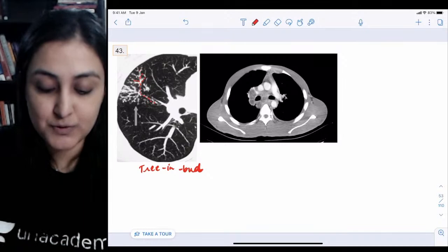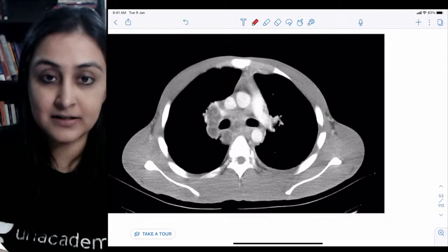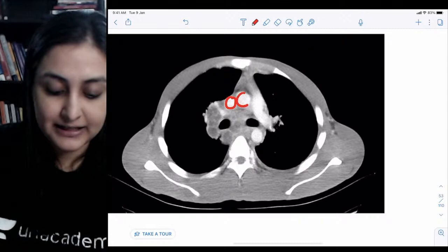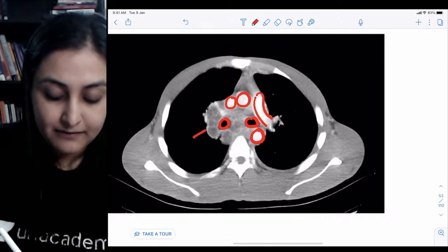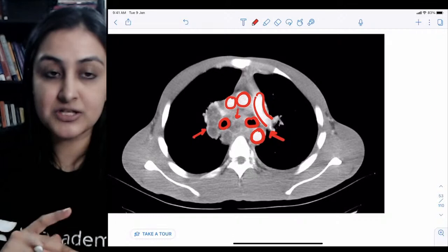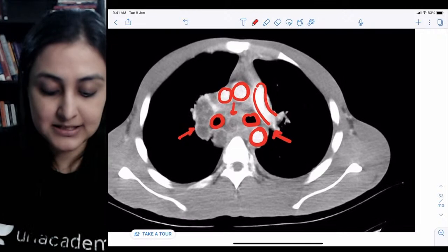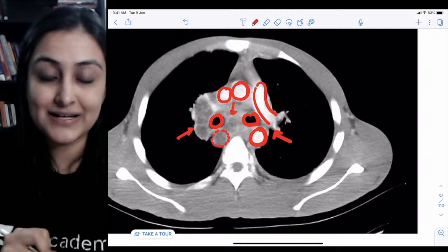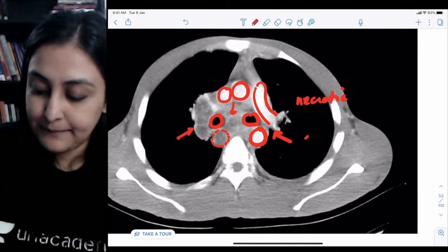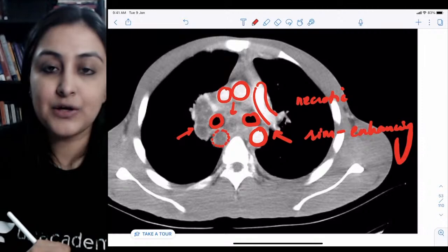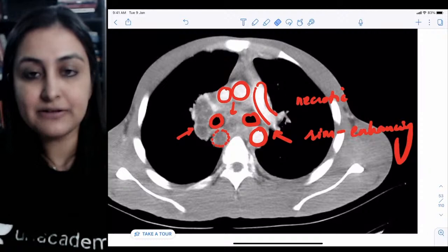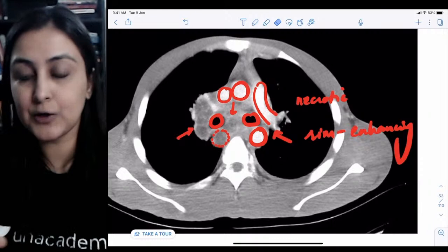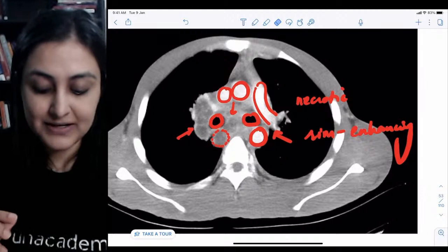The second finding indicating active TB is necrotic mediastinal lymph nodes. On this mediastinal CT section, you can identify the SVC, ascending aorta, pulmonary artery, descending aorta, and tracheal bifurcation. The subcarinal and other mediastinal lymph nodes show a peripheral white rim with a gray center — these are rim-enhancing or necrotic lymph nodes. They are also conglomerating into one another, which is a hallmark of tuberculosis.